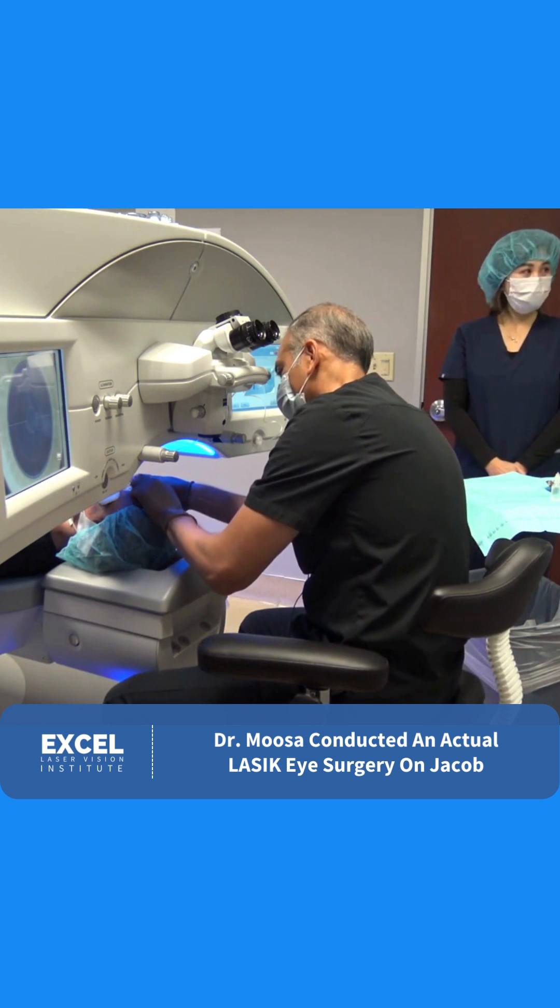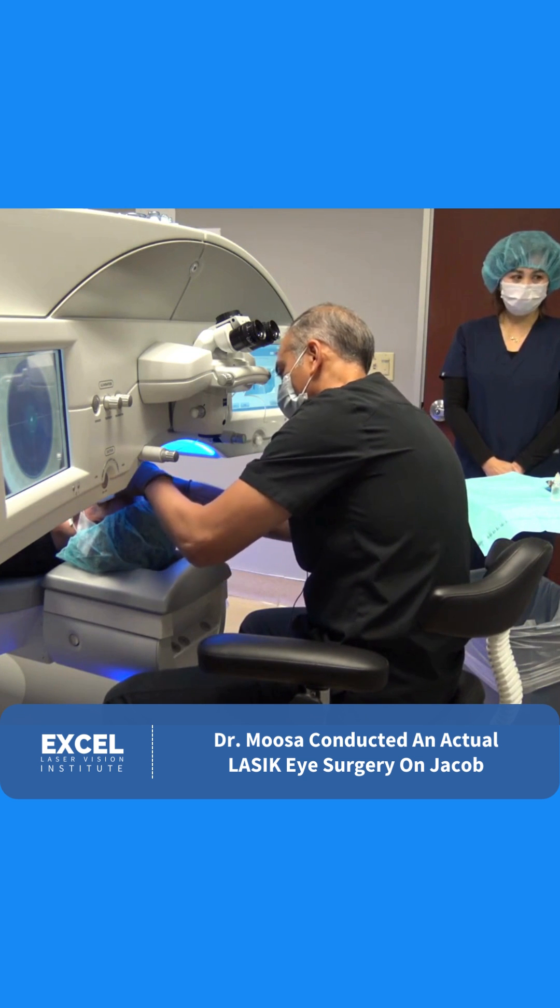Open your eyes for me, Jacob. Beautiful, looking great. Let me help you out here.